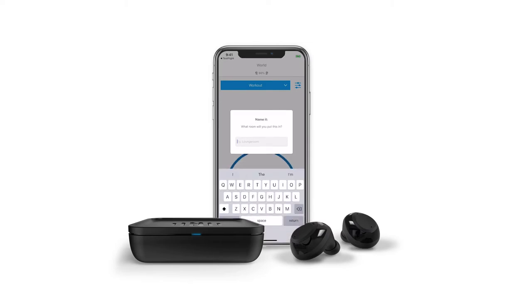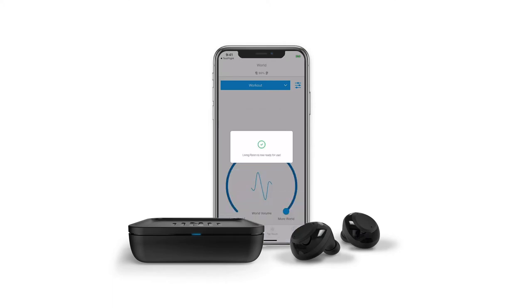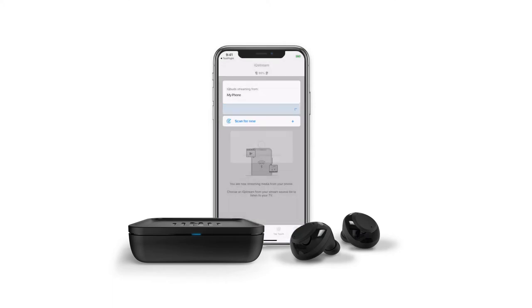Choose a name for your IQ Stream — whatever room you are in is a great name to use. Your IQ Stream is now ready for use. You will land on a screen that says you are streaming audio from your phone. Below this will be a list of your connected devices, and you will see the IQ Stream with the name you just gave it.